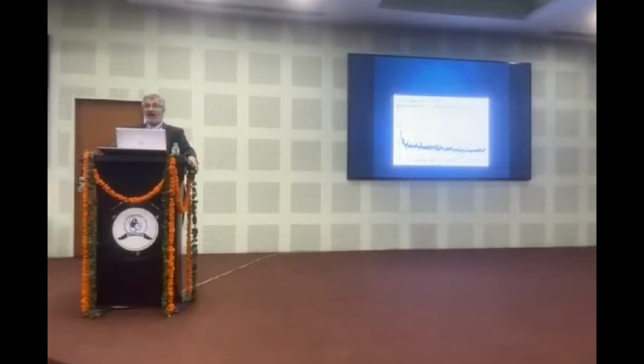Now, what I was extremely surprised by is that the size of the cage was not a factor. And let me repeat that, because nobody could have told me that and I would not have believed it. The size of the cage is a complication risk for other things like subsidence, but not for the rate of nerve irritation. Now, after the surgery, when it happens, again, you educate the patient that it's temporary.